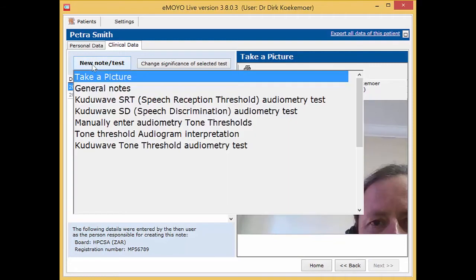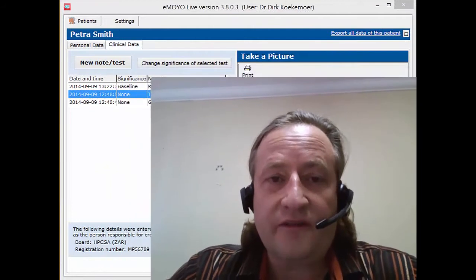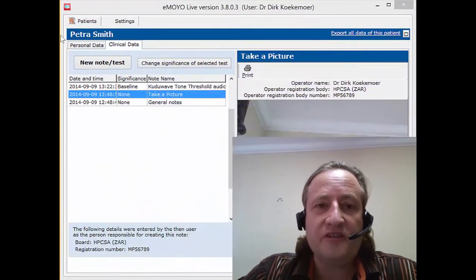I can click here and add other clinical notes too. For instance, the KUDUwave tone threshold audiometry test. In this video, I will demonstrate how to do a KUDUwave test on a patient to the South African standards for occupational healthcare.